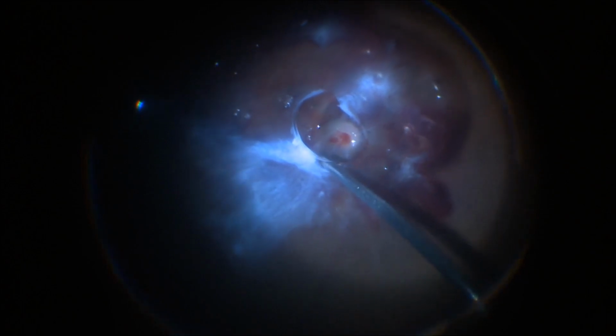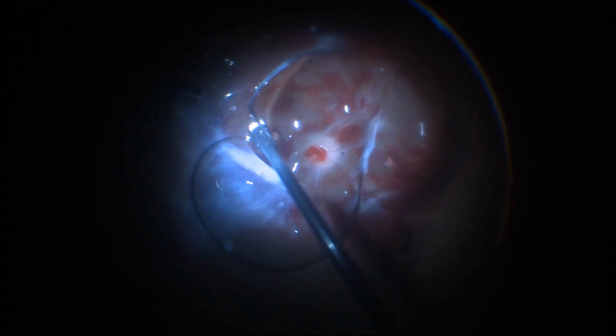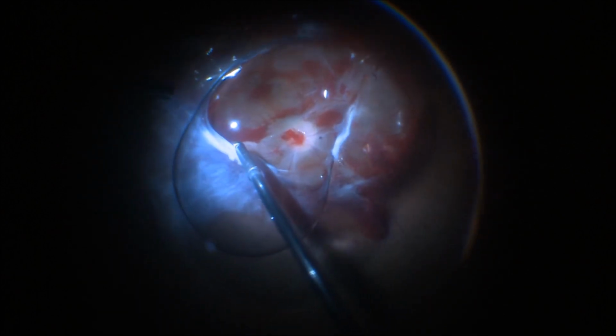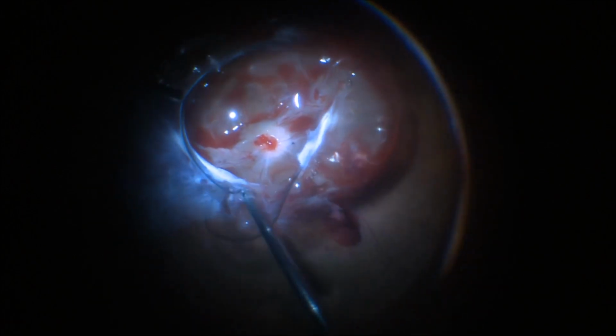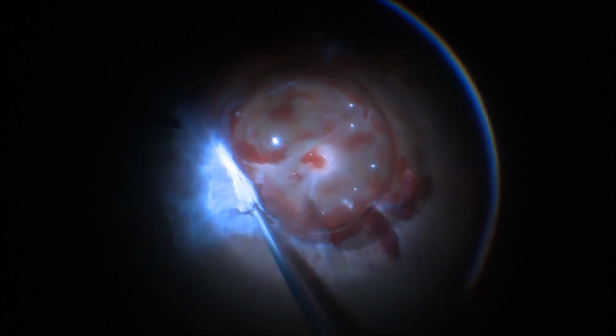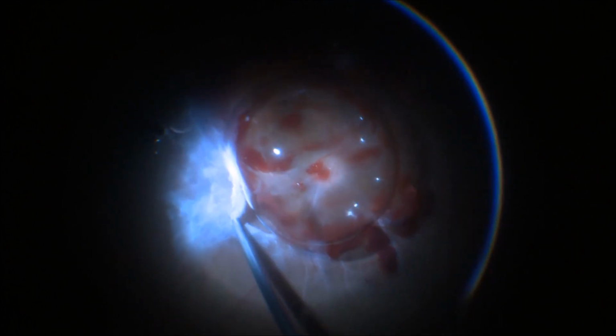So PFCL not only supports the underlying retina, it pressure tamponades the bleeders and it also prevents the formation of breaks. Further dissection is gently then carried out with the help of a cutter only. With the use of PFCL, the membrane dissection becomes much easier, and PFCL also protects the retina from undue traction leading to breaks.